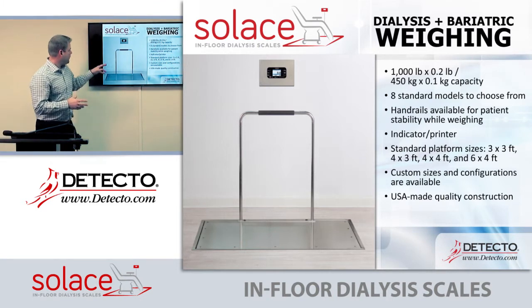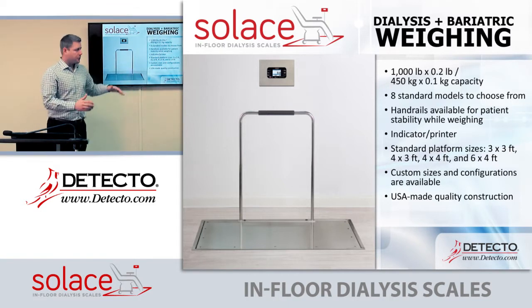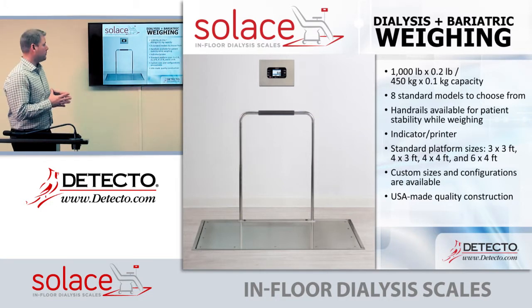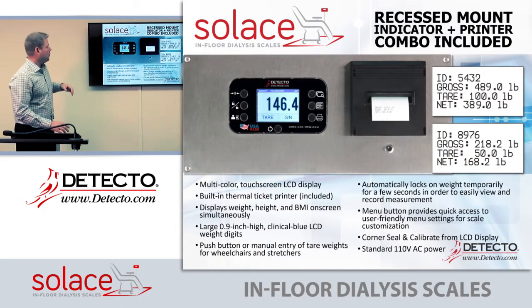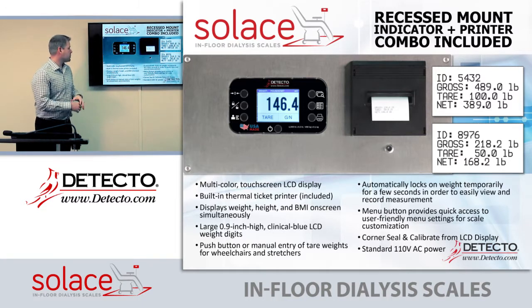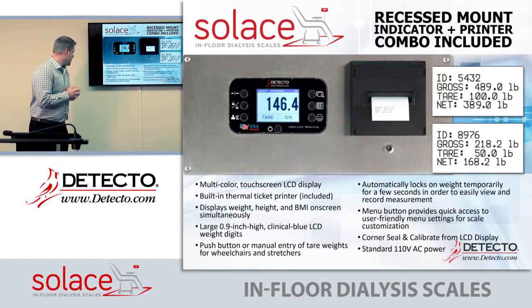The dialysis scale comes with an optional handrail. It's an in-floor scale with a 1,000-pound capacity by 0.2 pounds. There are eight standard models: 3x3, 4x3, 4x4, and 6x4 — custom sizes are available by calling customer service. Everything is made at our factory in Webb City, Missouri. The recess mount and indicator package can be provided with an instrument only or with an instrument and printer, featuring a full graphic touchscreen display that is very user friendly with nearly one-inch display digits.